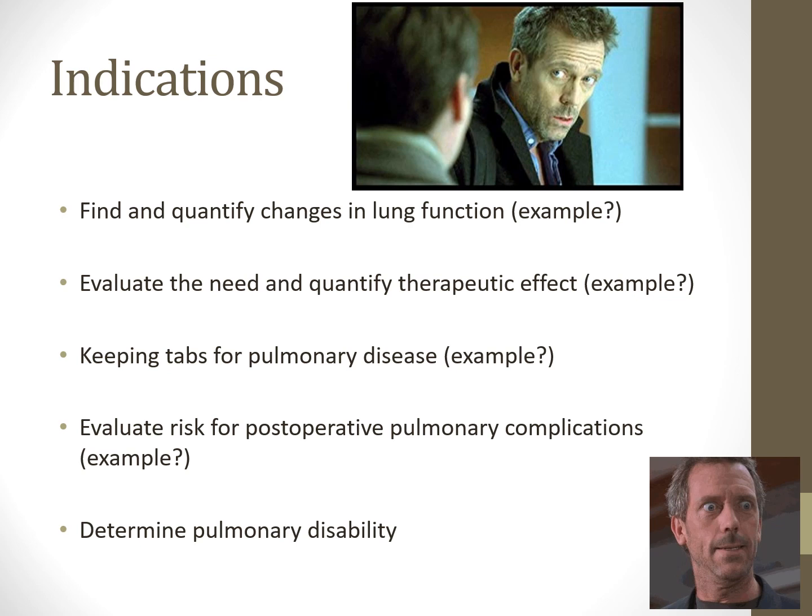So we can keep tabs on pulmonary disease. If they have pulmonary fibrosis, then we can see how bad their DLCO is getting and keep tabs on it. If it's obstructive disease, we can keep tabs on how their FEV1%, or how fast they can exhale, is changing over time, and then we can change the strength of our medications.